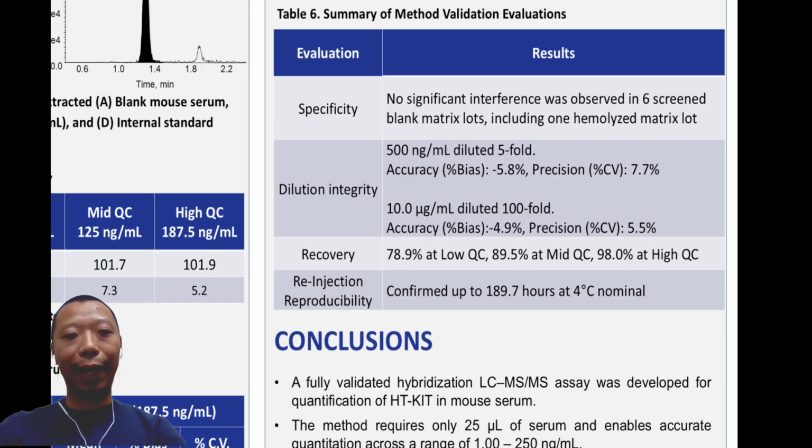The method showed excellent specificity with no significant interference in 6 screened blank matrices, including 1 hemolyzed lot. Dilution integrity was demonstrated up to 100-fold, maintaining accuracy within 20% and the precision below 8%.